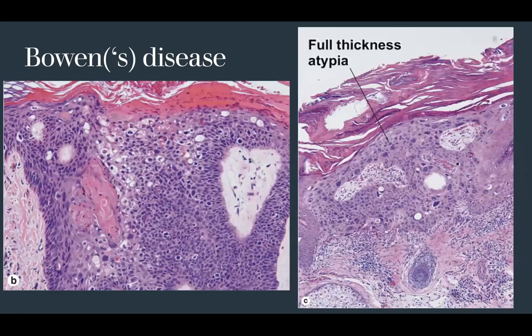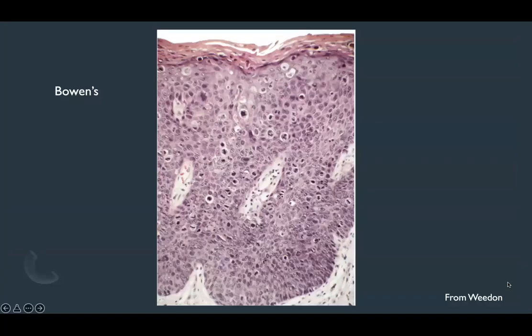Additional examples from textbooks demonstrate Bowen's disease or squamous cell carcinoma in situ with large hyperchromatic nuclei of keratinocytes located high up near where the granular layer should be at the top of the stratum spinosum, showing another example of full-thickness atypia.